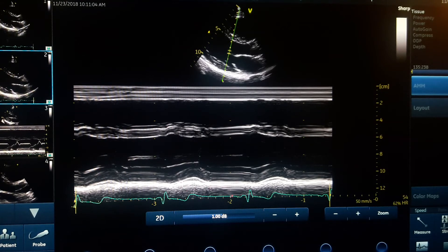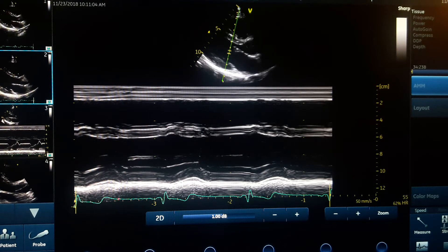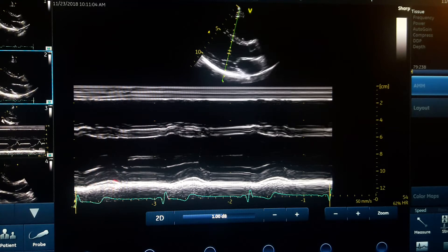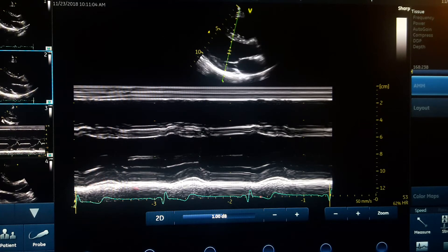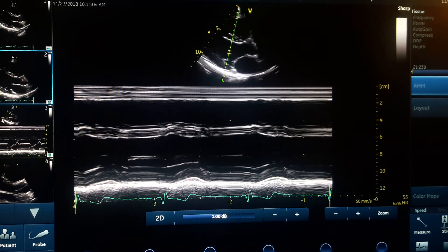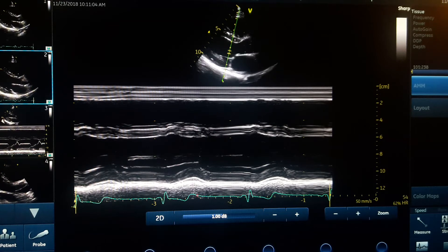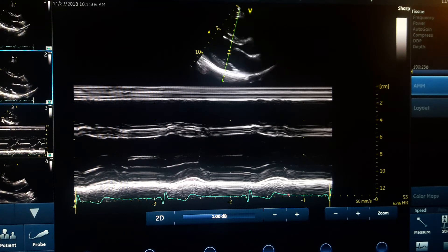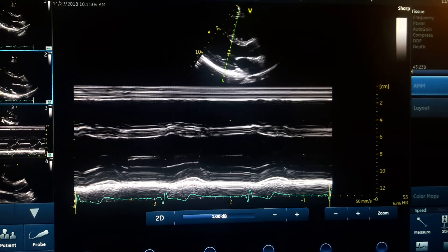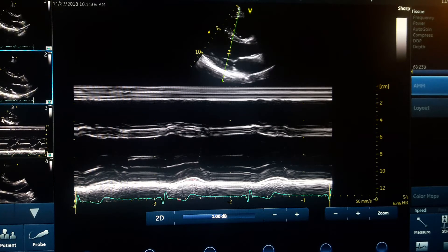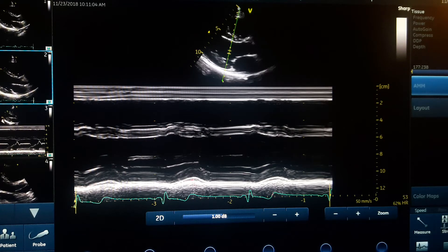Here is a hyperechoic line representing the epicardium — a little thick. Some part of it is because of the diaphragm, so the combination of the diaphragm and epicardium gives you a hyperechoic layer.